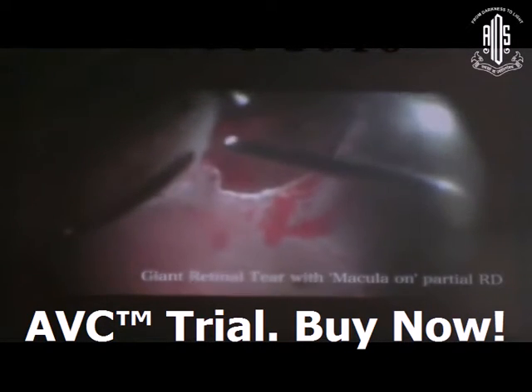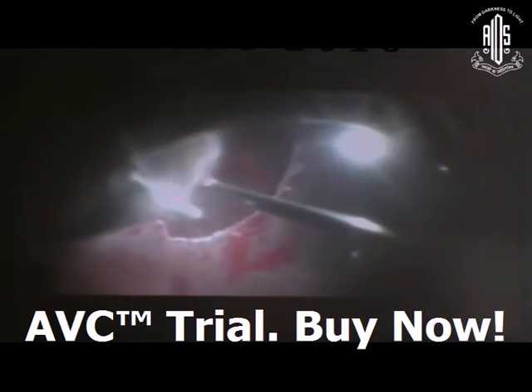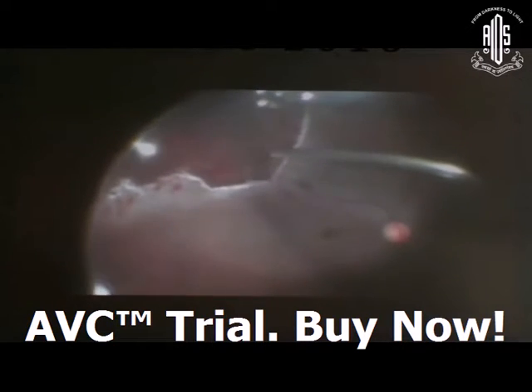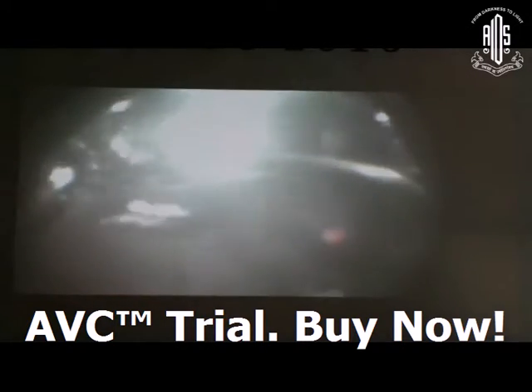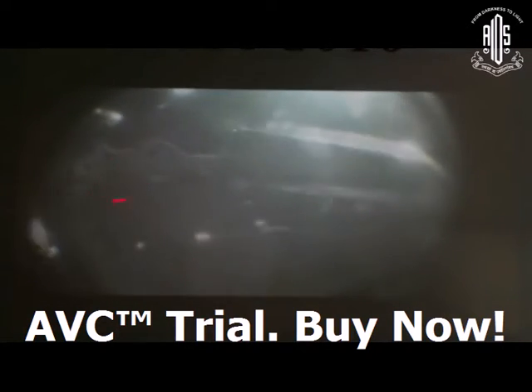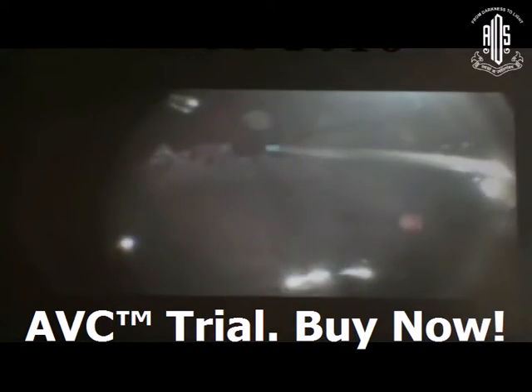Cauterize all the margins, trim the margin, and do good suction around all the infusion cannula as well as the periphery. A simple fluid exchange without any PFCL can manage this kind of situation, and you can do laser around the break.